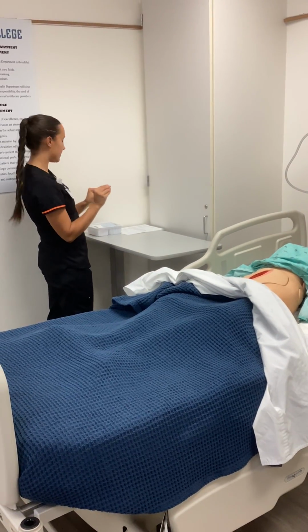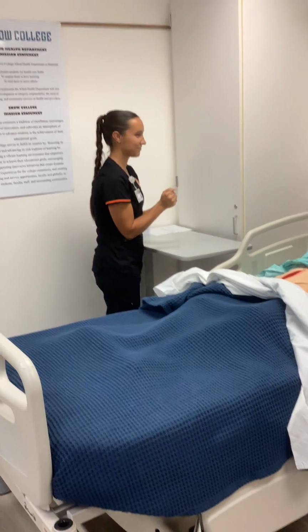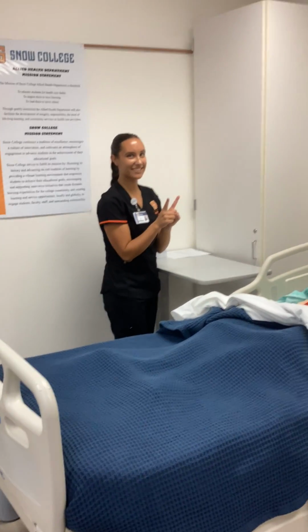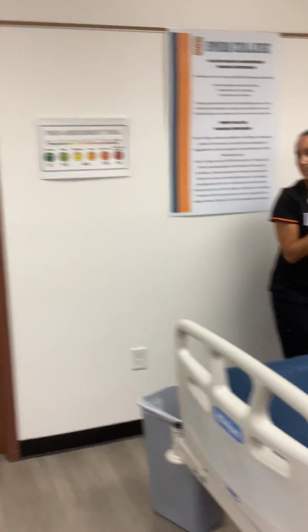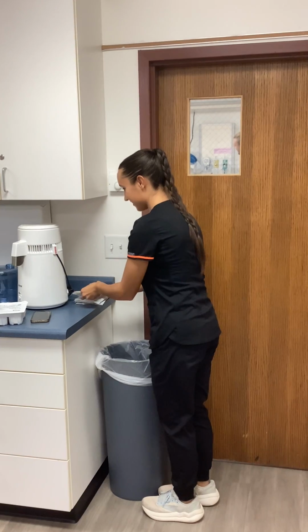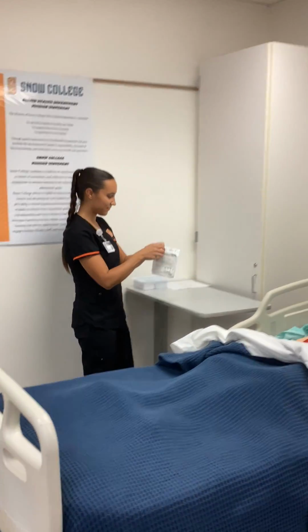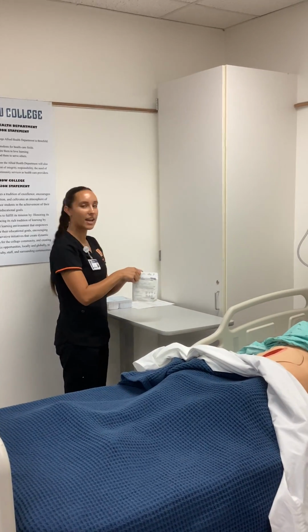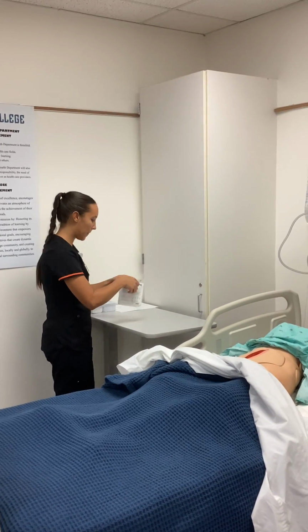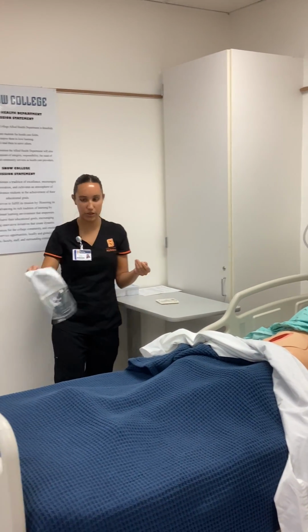Okay, I'm going to get my gloves out. I'm going to open. Okay. I'm going to grab some new gloves. I'm going to open these gloves up, and I'm going to plop it on the table, and I'm going to throw this away.